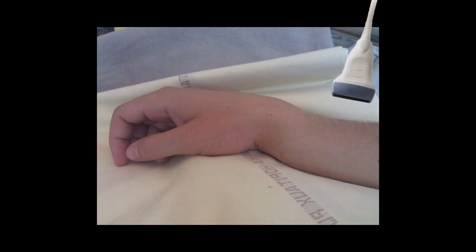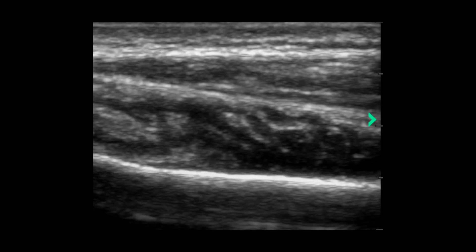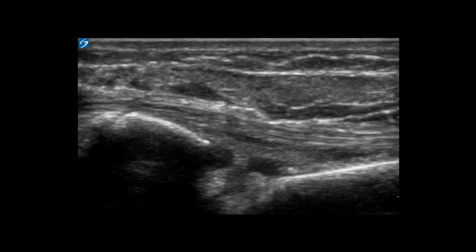Go ahead and place the probe on the bone proximal to the fracture in the longitudinal view. What you're looking for is this smooth hyperechoic line that represents the cortex of the bone. You'll then take the probe and slide it distally until you arrive at the fracture site. When you reach the fracture site you'll notice that the hyperechoic line representing the cortex has an obvious disruption.